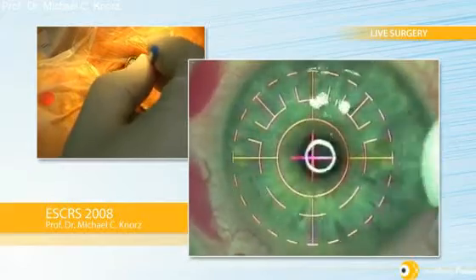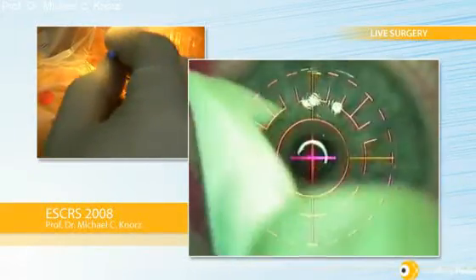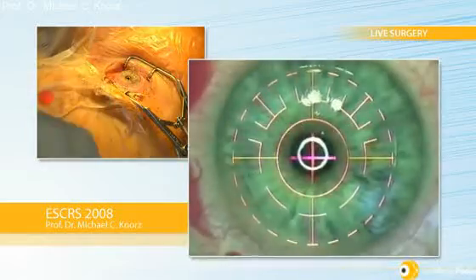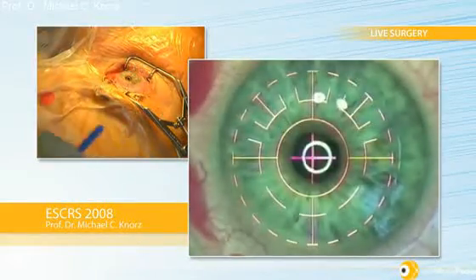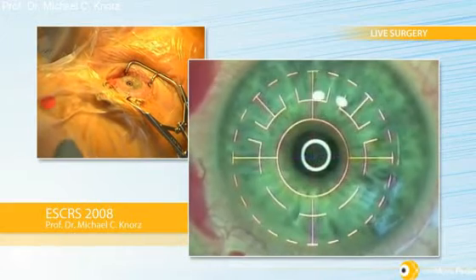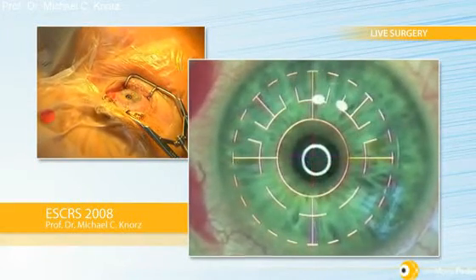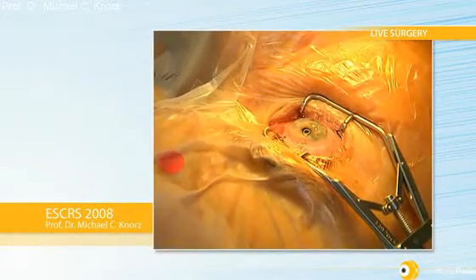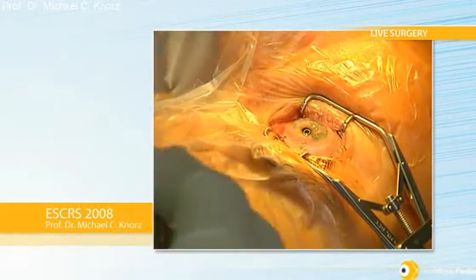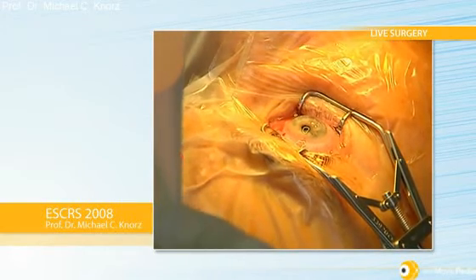The eye looks much better, with much stronger healing and probably better visual results as well. This was very easily done here — everything worked very well. I'll wait about 30 seconds and then we will move on to the fellow eye. I usually do both eyes simultaneously, as most surgeons do.